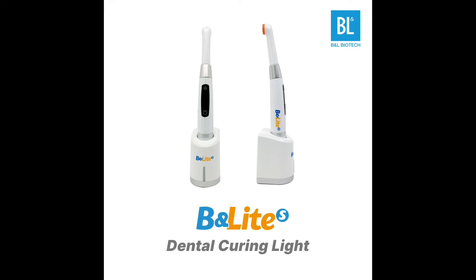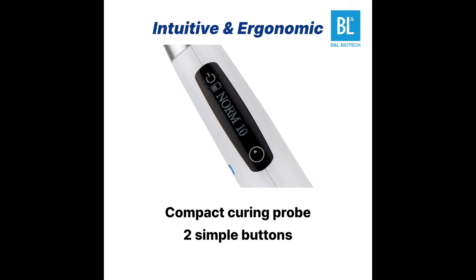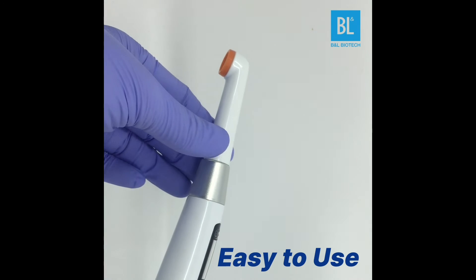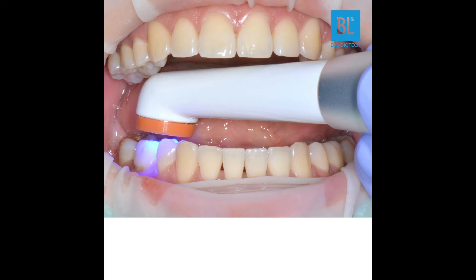BNLight is a dental curing light from BNL Biotech. As you can see, it features an intuitive and ergonomic design. It is easy to use because of its rotatable head, and its small head allows easy access inside the mouth.